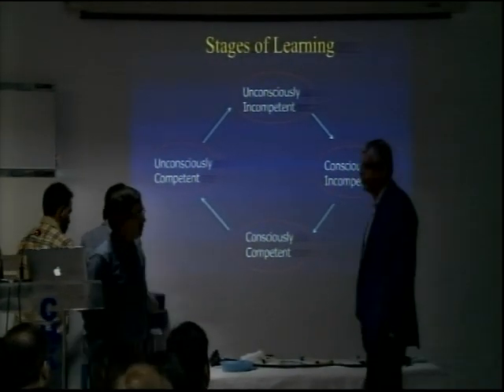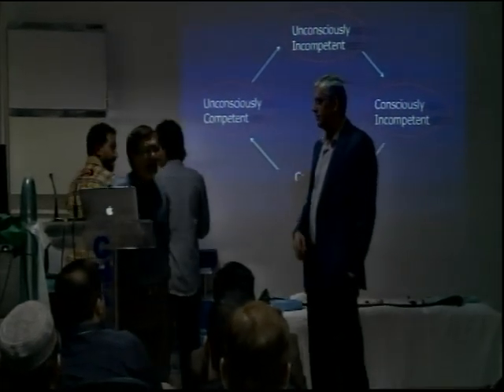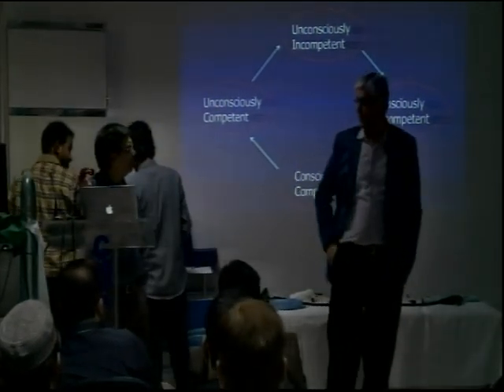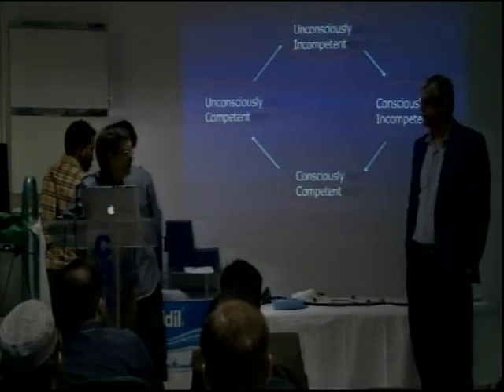What do you normally do? Below up or up down? I do both, depending on the papilla. I could do more below up.